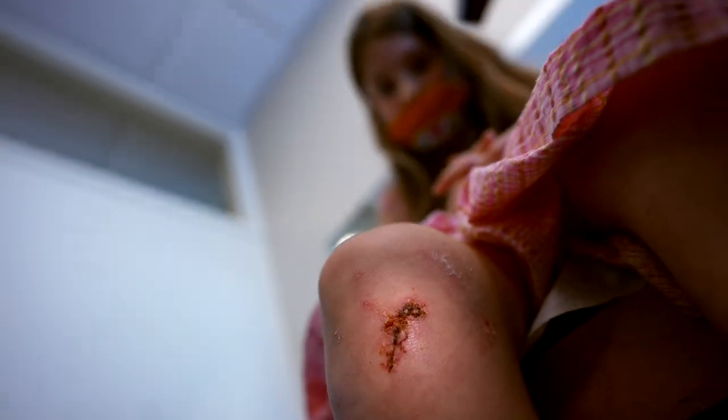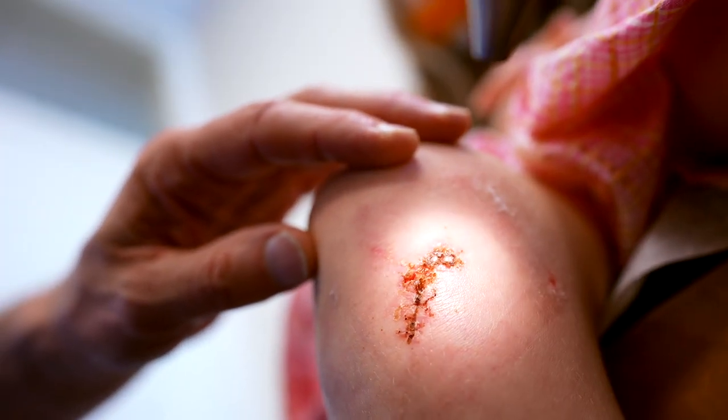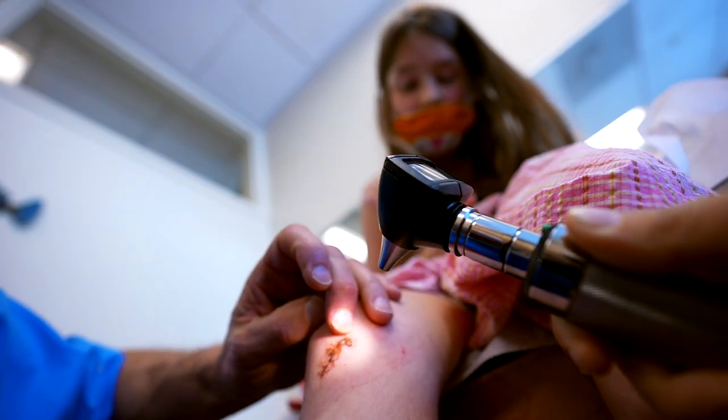Do you see any stitches left? Those aren't any in there — I think those are just scabs, right there and there. That's what I thought too. You think it's a stitch or it's a scab? No clue. I think that was like two more stitches, but maybe they're just deep. I think we got them.